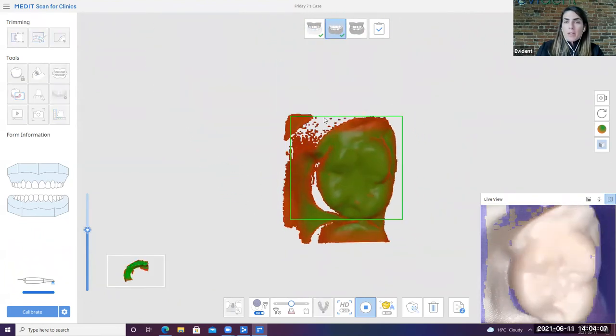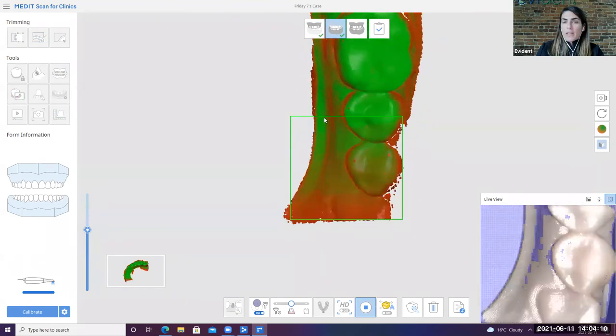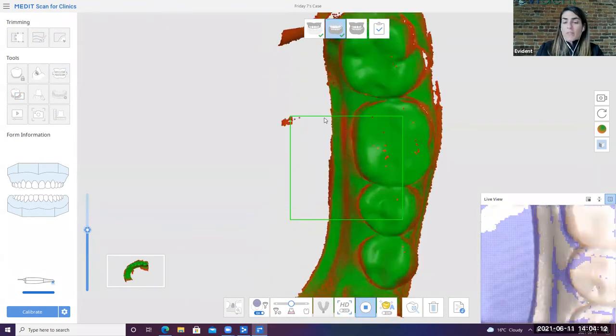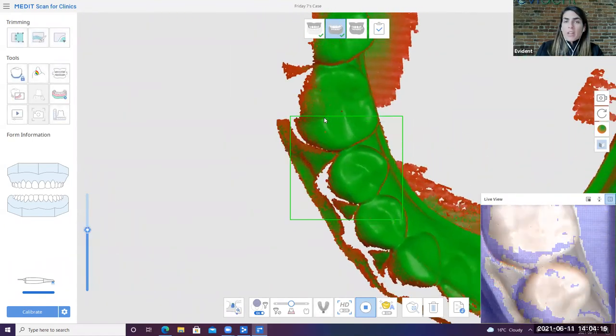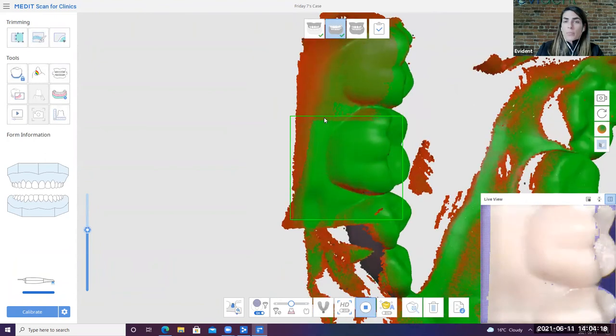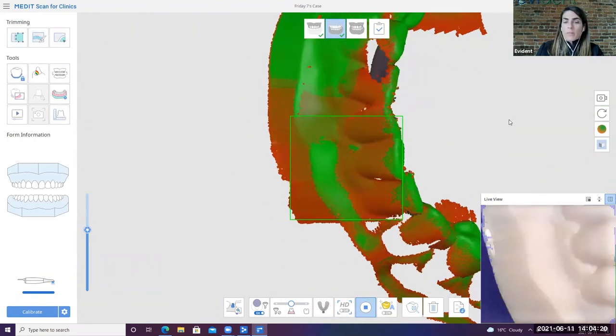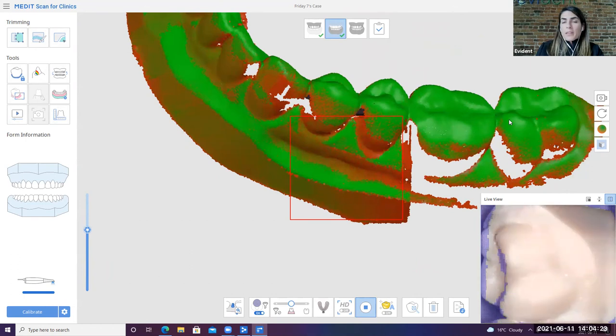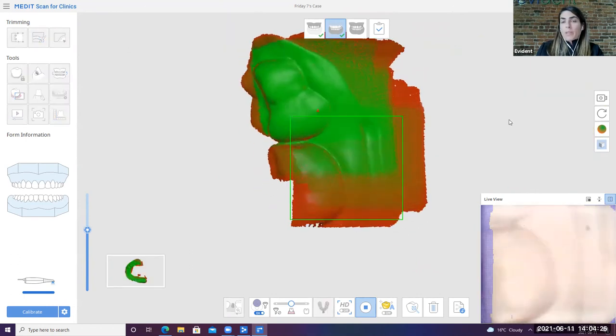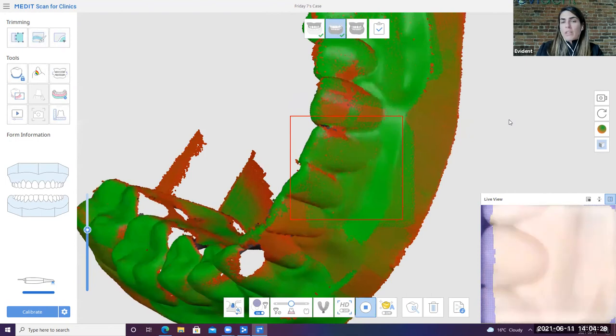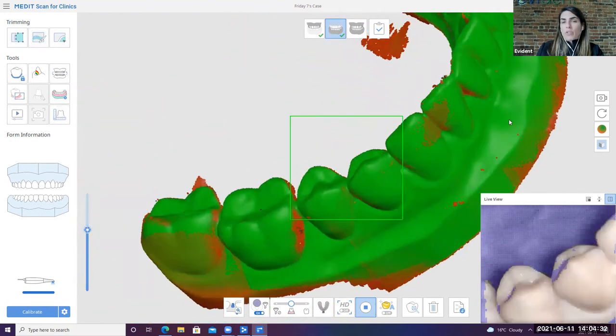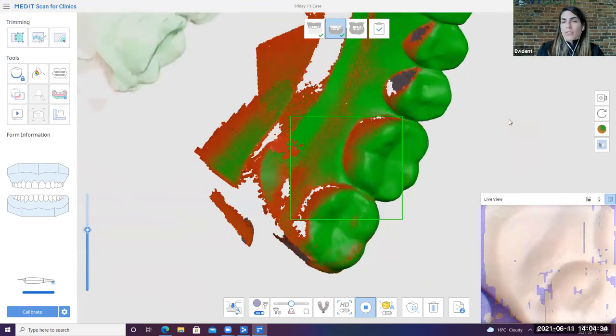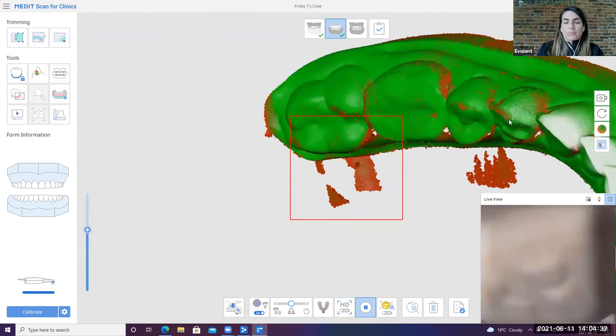So the Medit's got a few different ways of acknowledging where your scan is. So as you can see on the right hand side, you have the live view that's come into play. On the right side, you have your smart stitch and then in your main screen, you've got your big image that's in the readability map that we're currently looking at. The other thing too, is that the Medit actually has the opportunity for you to play music while you're scanning, which allows you to give, which gives you an audible tone to show, ensure that you're on track and that you're staying in that connectivity with the teeth.